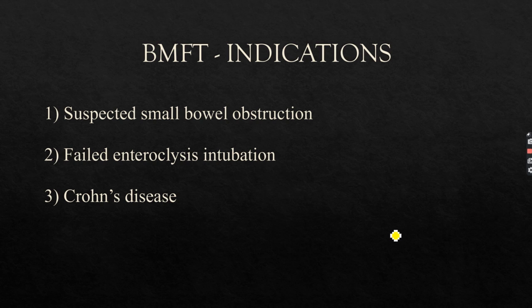If we have tried enteroclysis intubation, I'll come to this word, what is enteroclysis intubation? After 10 to 15 minutes, it will be clear to you what is enteroclysis and what is enteroclysis intubation. If it has failed, failed enteroclysis intubation, now no choice as far as the barium studies are concerned, so we'll go with BMFT. If the patient is suffering from Crohn's disease, again, for demonstrating the various strictures and mucosal lesions, BMFT could be one of the options in Crohn's disease.